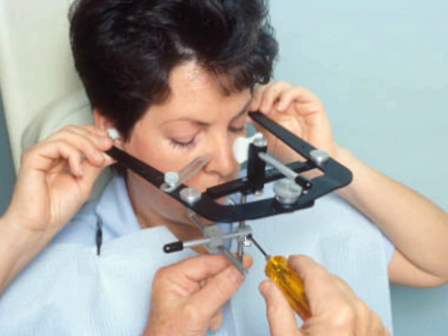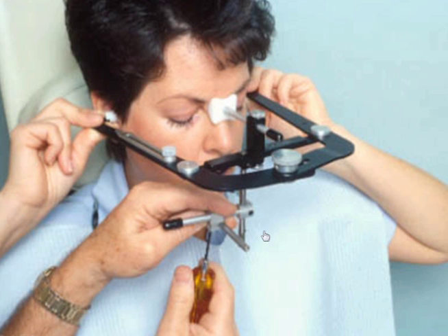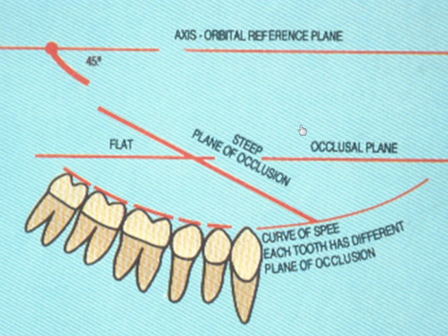Then we can tighten the horizontal clamp here, which will help support the Facebow at that location. With the Panamount Facebow, we also have a nasion relator, which relates the upper surface of the Facebow 22 millimeters below nasion where the lower border or orbitale is. So we push the nasion relator in against the patient's nasion and tighten in place with the screw. We can then tighten both clamps very tightly, capturing the plane of occlusion to the plane of reference of the patient. So we now capture the plane of occlusion as it relates to the axis orbital plane of reference.